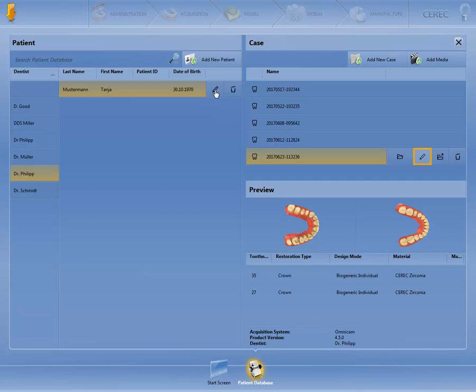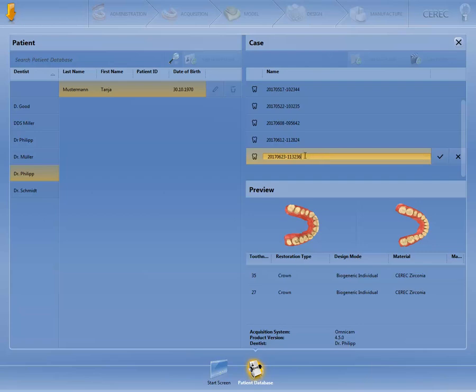By using the pencil symbol, you can change the name of the case. The changes are saved by clicking on the check mark.